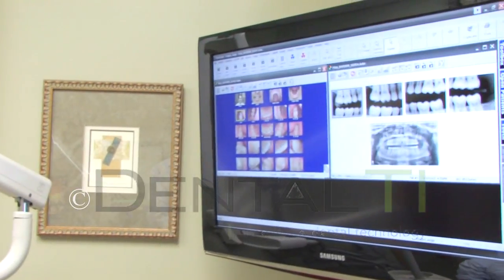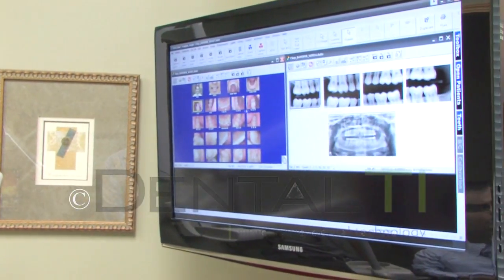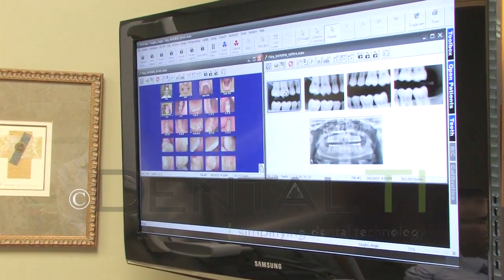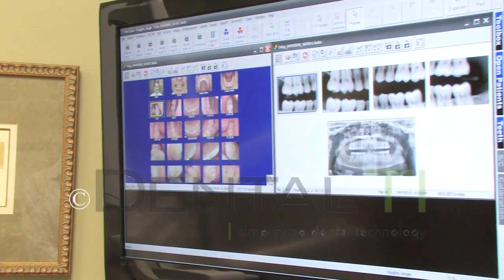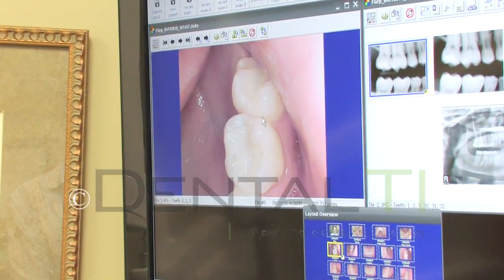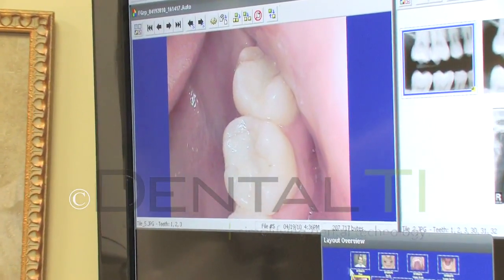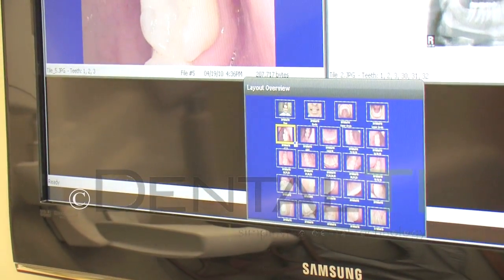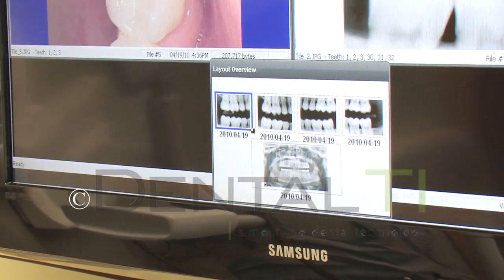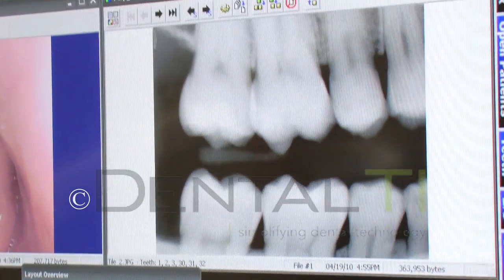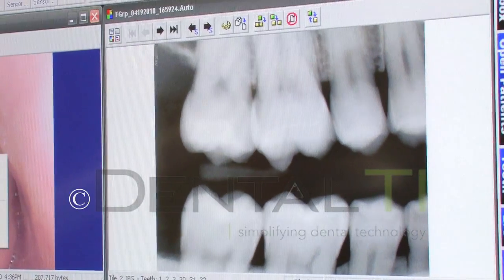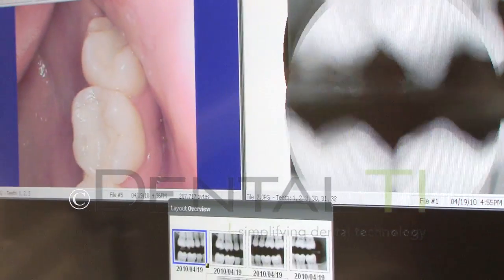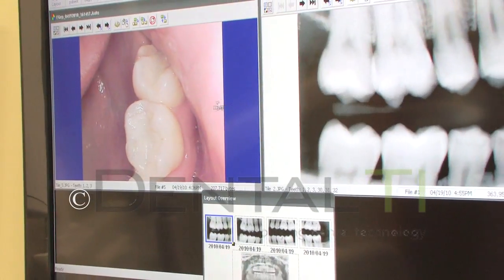This is how Dental TI recommends having the camera images and x-rays set up when the doctor walks in. That means you can double click on an image in the camera layout, double click on the corresponding x-ray image, and have a camera image right next to an x-ray image of the same area.